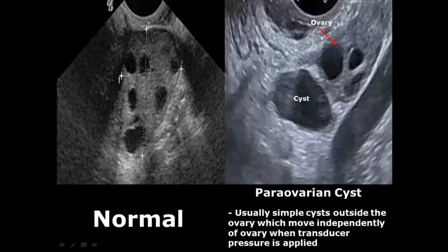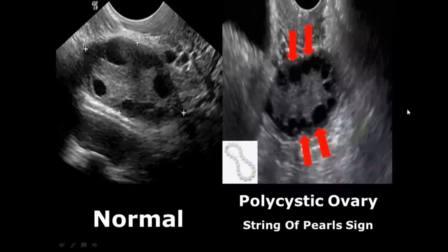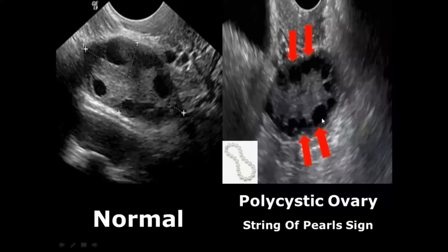Paraovarian cysts are simple cysts outside the ovary and move independently when transducer pressure is applied. Polycystic ovary occurs when there are more than 20 cysts inside an ovary, with follicle sizes ranging from 2 to 9 millimeters. Due to multiple cysts, this gives a specific appearance called the string of pearls sign — the cysts are lined up together looking just like a string of pearls.